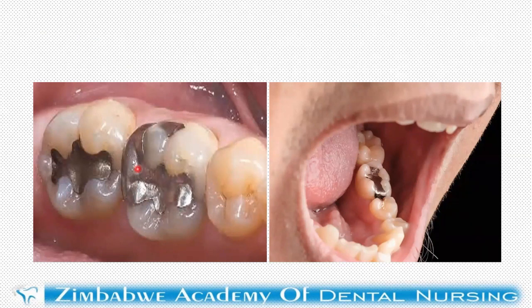So this is a dental amalgam filling. Many of the dental assistants, dental therapists and dentists who have joined are familiar with this. But we may have visitors who are not therapists, dental surgery assistants or dentists, so I'm going to take a few more minutes. As you can see, this dental amalgam is nicely polished, shiny and smooth, and clearly we shouldn't have any health problems as a result of this filling material.